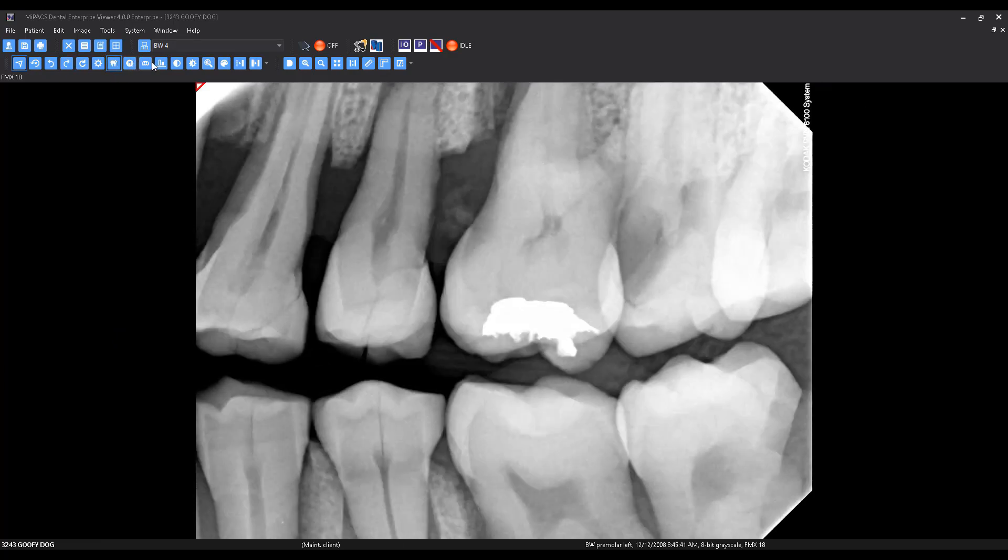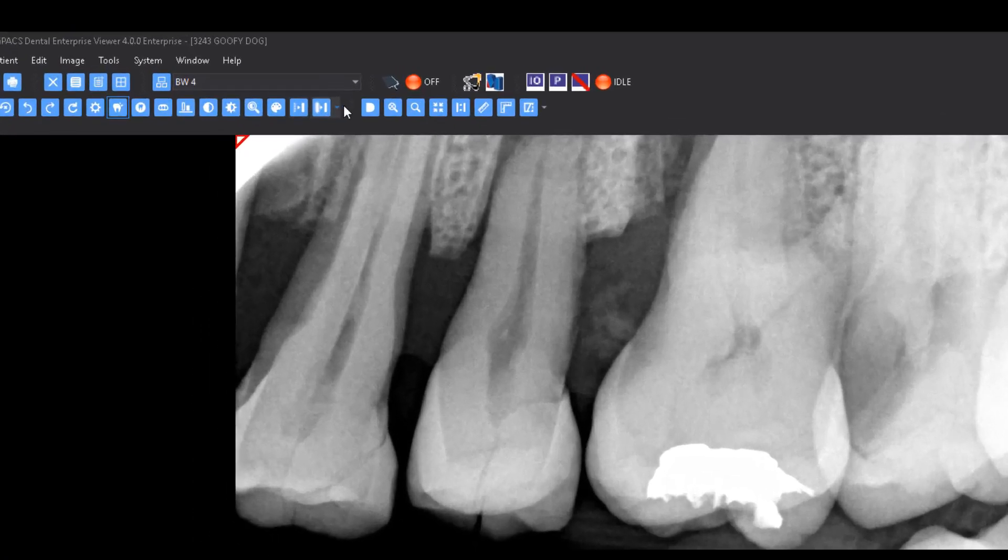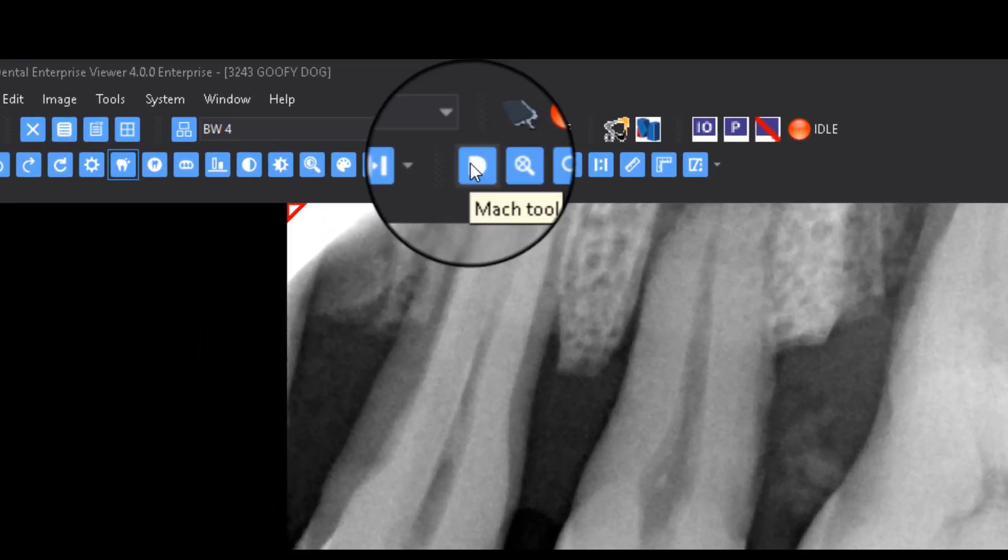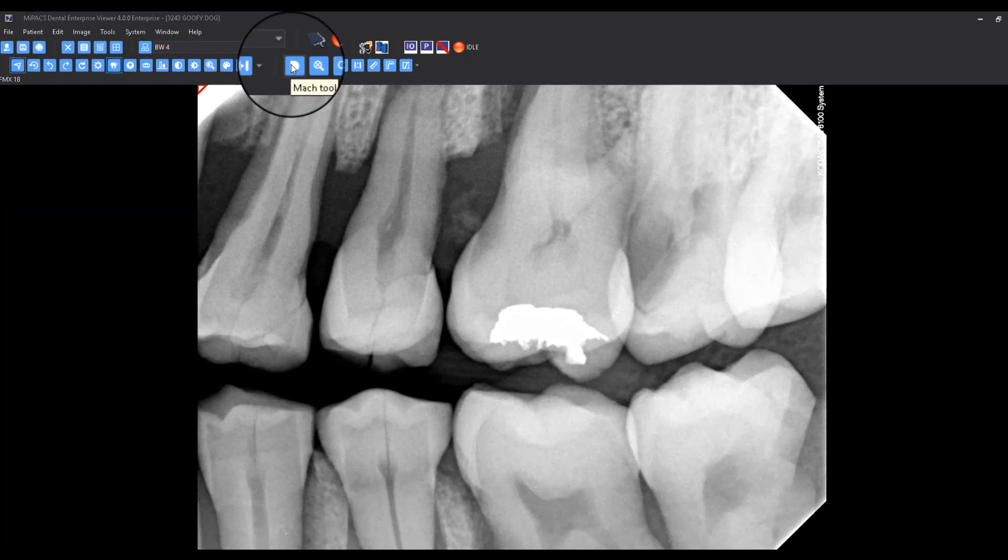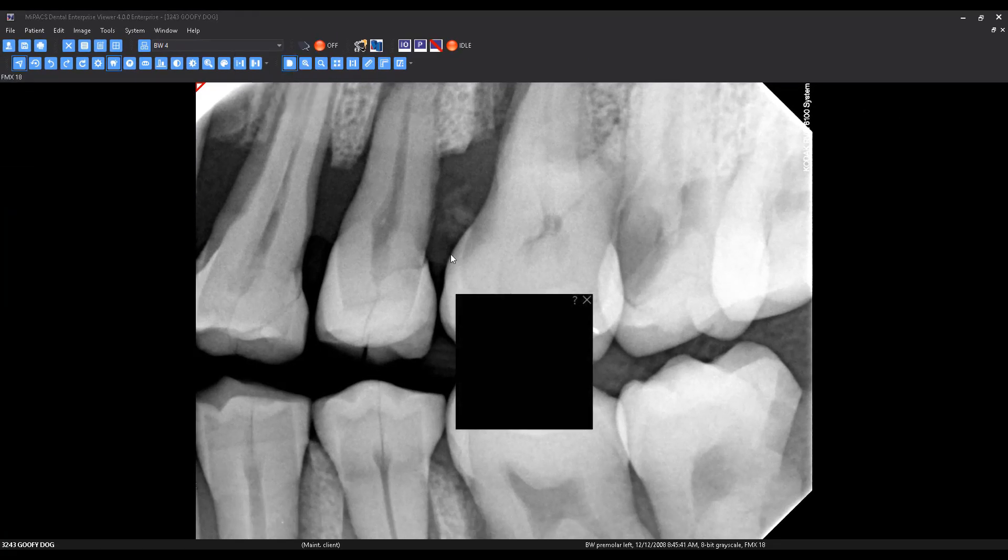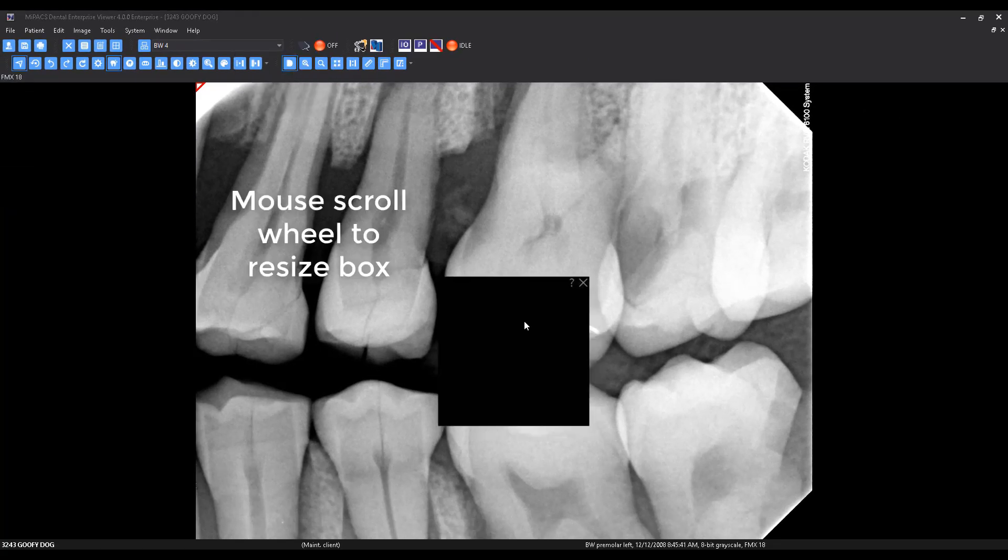To use the Mach effect tool, select the Mach effect button from the toolbar. This will display the Mach effect dialog, which you can place anywhere on the image to help with diagnosis.